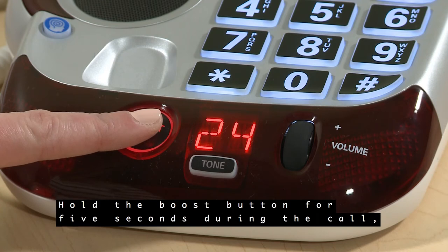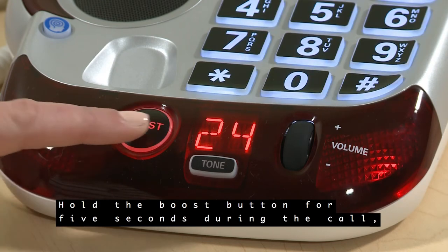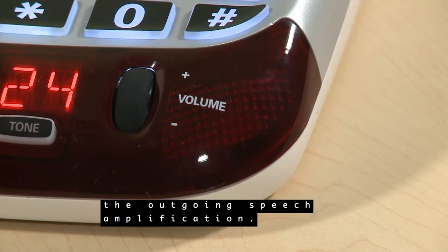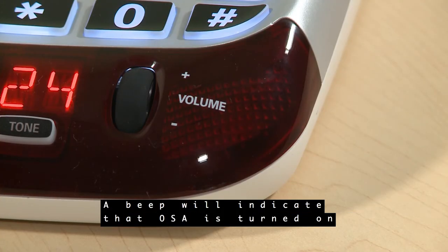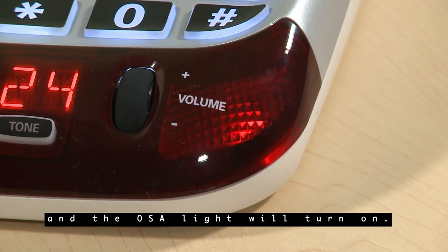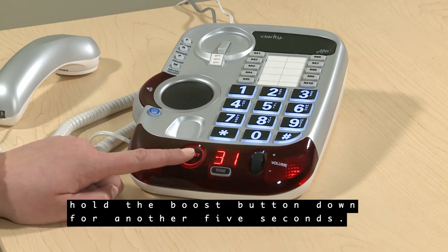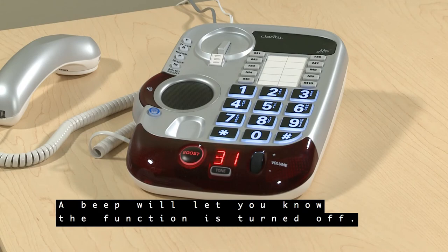Hold the boost button for five seconds during the call or in standby mode to enable the outgoing speech amplification. A beep will indicate that OSA is turned on and the OSA light will turn on. When you are done with this function, hold the boost button down for another five seconds. A beep will let you know the function is turned off.